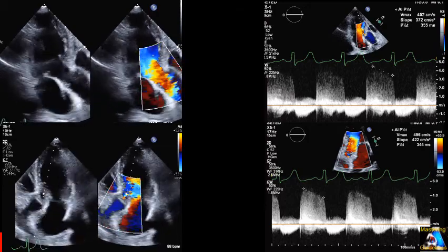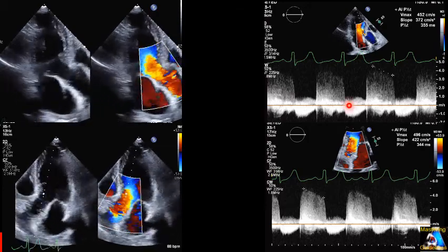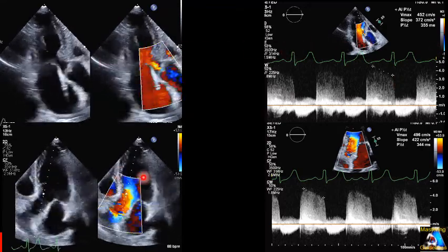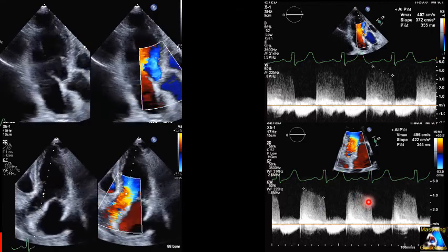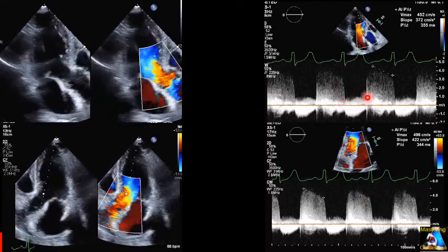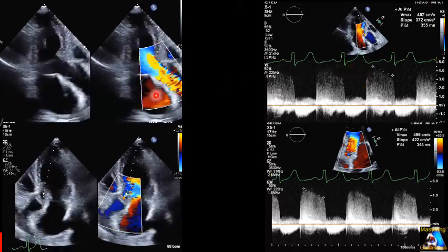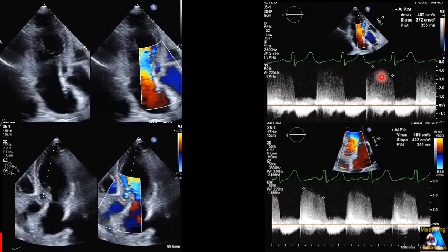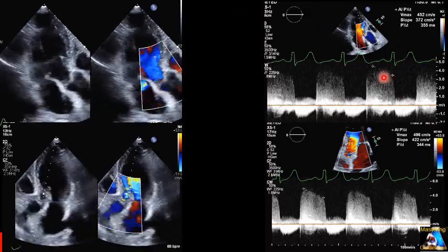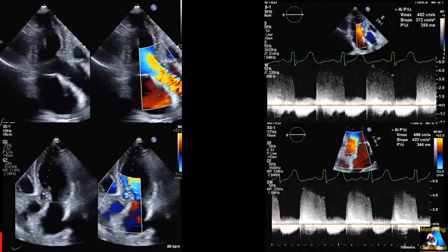Here we have scanning of a patient in apical three-chamber and apical five-chamber views. Based on the findings on the right side, each belongs to the respective view. This one belongs to apical three and this one to apical five. Which one do you choose for calculating or grading regurgitation — apical three or apical five — and why? Which one is more correct?